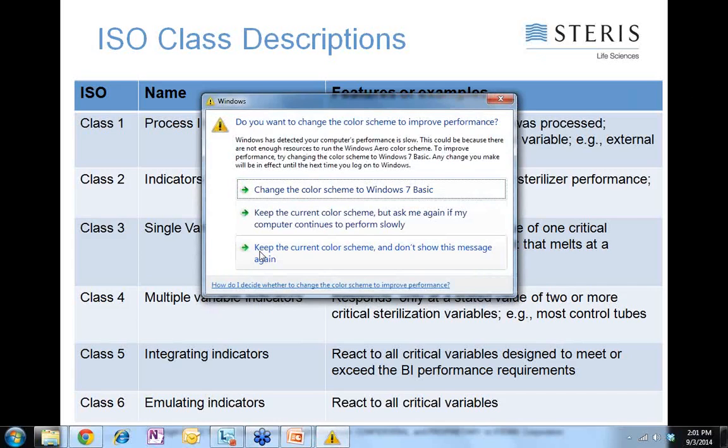We want to look at some common challenges and some mistakes that are made along the way that we've witnessed in the process of sterilization. I have some of these categorized under the specific principle that it applies to. Some of these slides are just more specific to certain particular challenges.